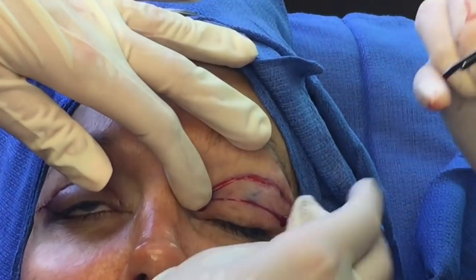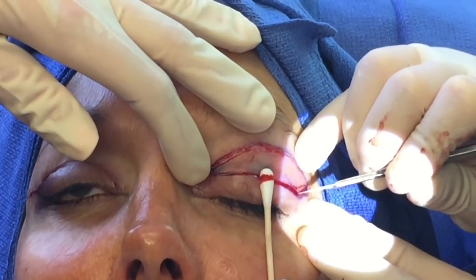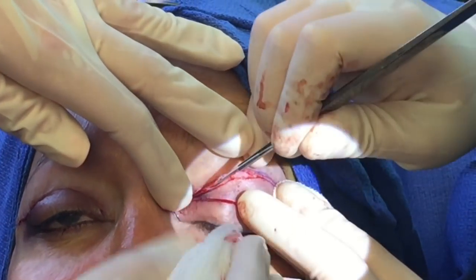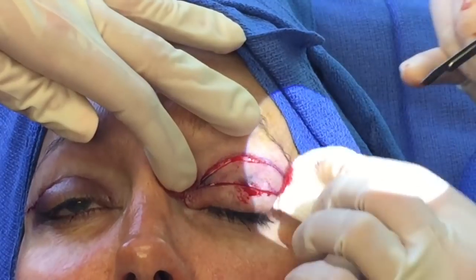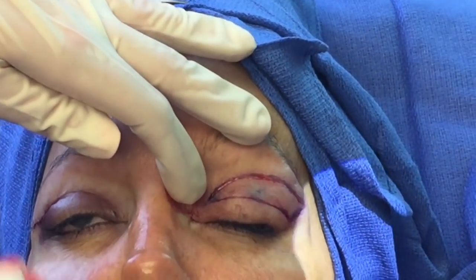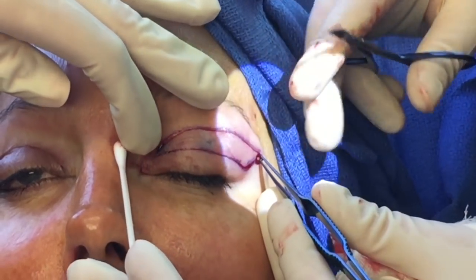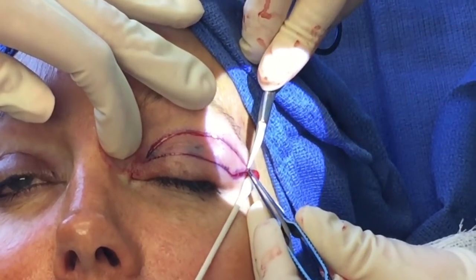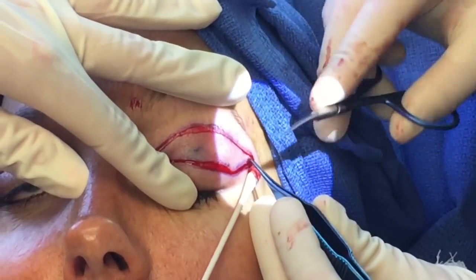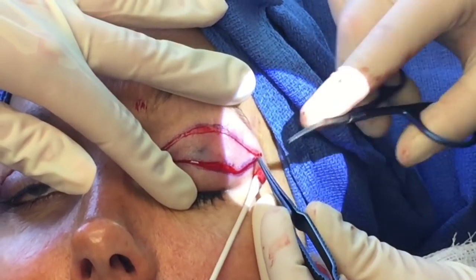Removing the skin now. I do a lot of these eyelid procedures in the office — when done by itself it's very comfortably done. When I'm doing more than just the eyelids, sometimes I'll do it under general. I am a double board certified facial plastic surgeon. What's unique about our practice is that each surgeon is very specialized. I do mostly all facial rejuvenation — surgeries on the face. Eyelids are probably my most common procedure, along with facelift surgery.